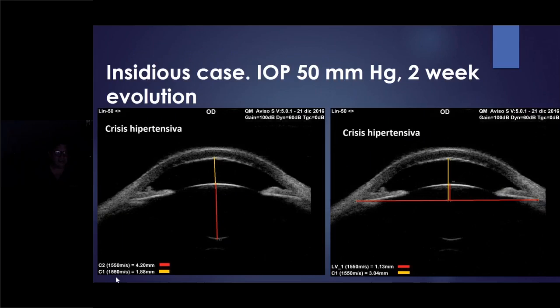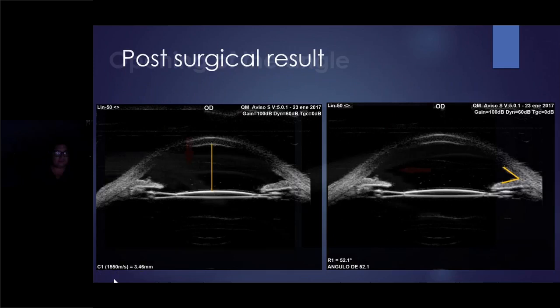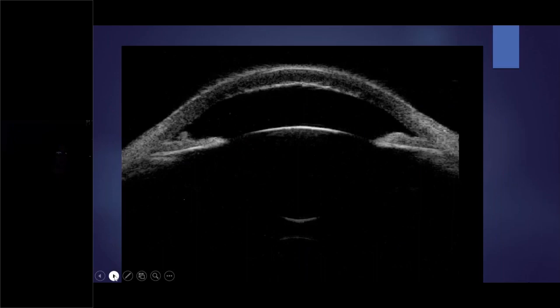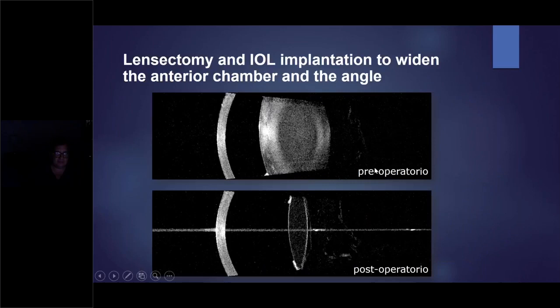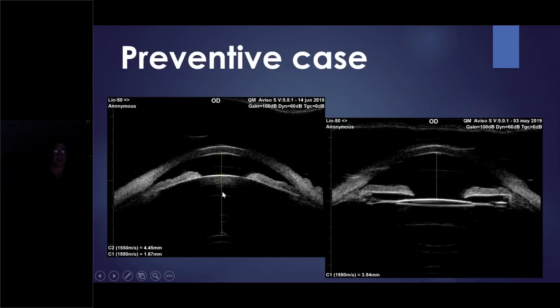One month later, like this, and the problem was the angle was not open. We got a big anterior chamber post surgery, but it was not enough. And look, this is with IOL Master, we can see the position of the lens in the same patient, preoperative and postoperative. Look how deep is the anterior chamber. You can imagine the angles also. If I make the reflection, what happened is that in this kind of patient, look, this is a 4.45 lens, 1.67, and the angle is almost closed. You have a high hyperopic correction. For me, the risk was present.